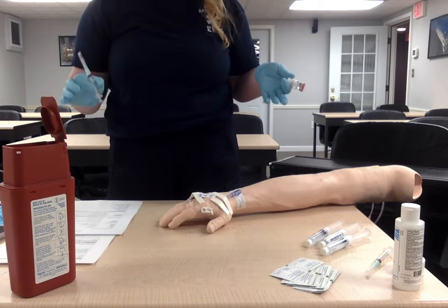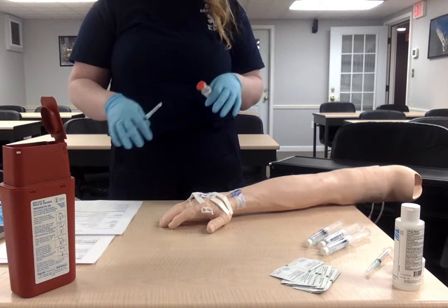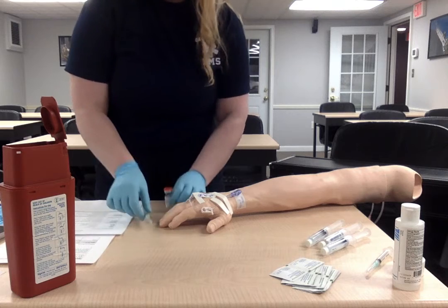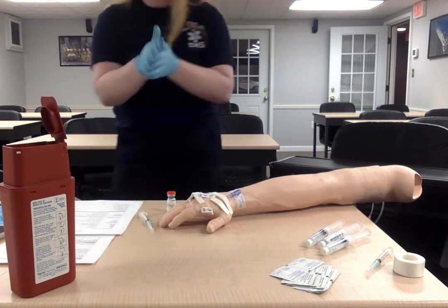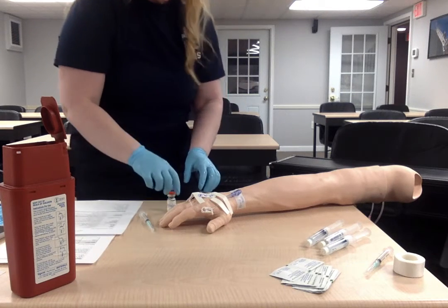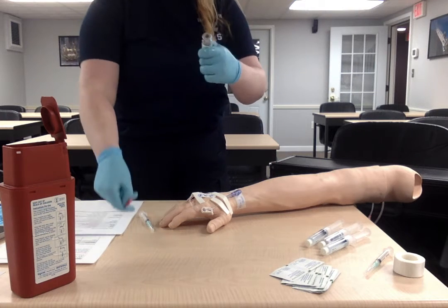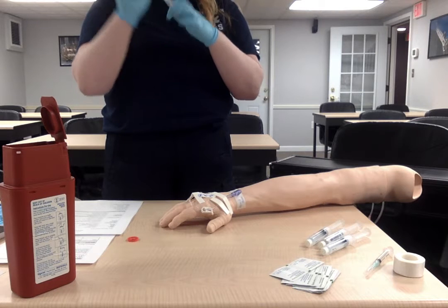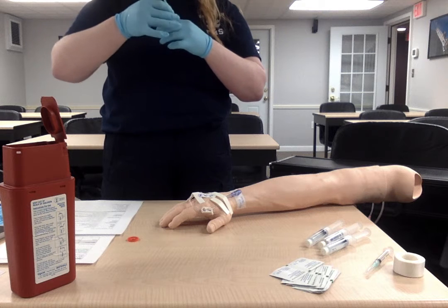So once we open it, we need to make sure that it doesn't touch anything and that the cap is placed back on once we're done. So we have all of this. Before we do that, I'm going to do some hand hygiene. Make sure that's all set, so we have clean hands when we're opening the meds. New gloves. So from this, like I said, nothing's touched this. This is sterile. Pop this off without touching anything. We have the cap to this. We still have our sterile gloves that we haven't touched with anything, so we can put that there.